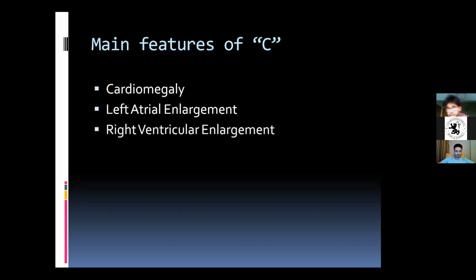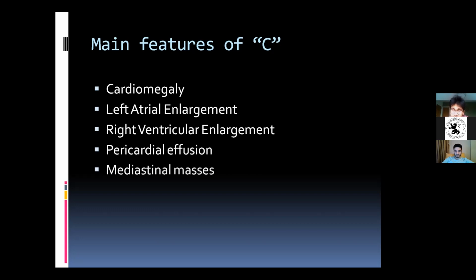Right ventricular enlargement, pericardial effusions, and finally mediastinal masses as well. And the hila signs as well, which we'll cover.